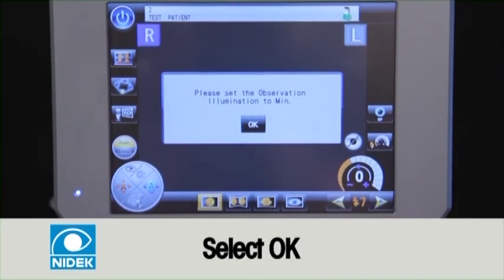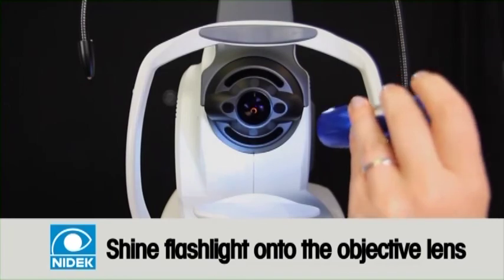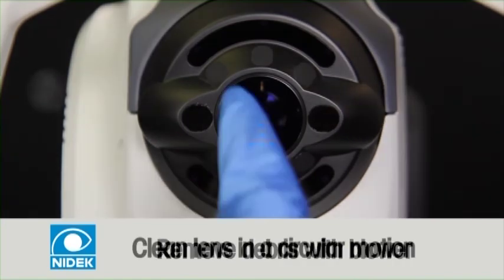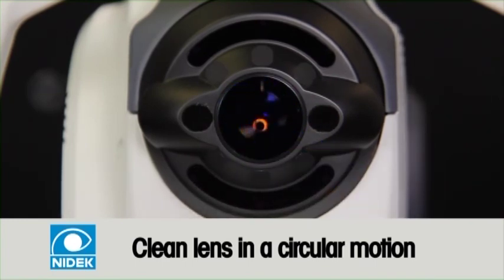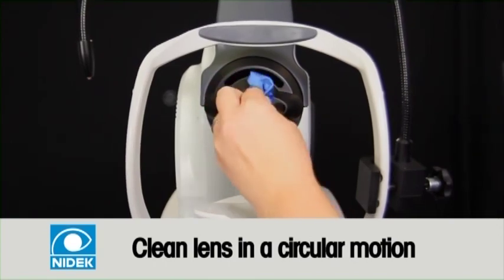Reduce the infrared lights to minimum and press OK. Shine flashlight onto objective lens. Using the blower, remove any loose debris. Wrap the clean microfiber cloth around your finger and rub lens in a circular motion. To clean the very edge of the objective lens, place the cloth completely into the opening.